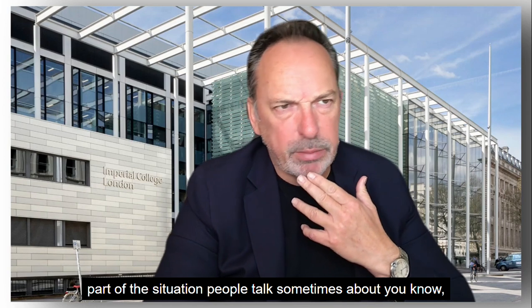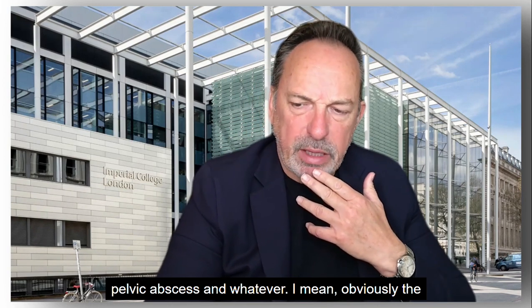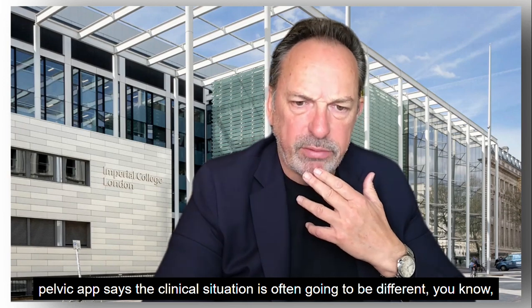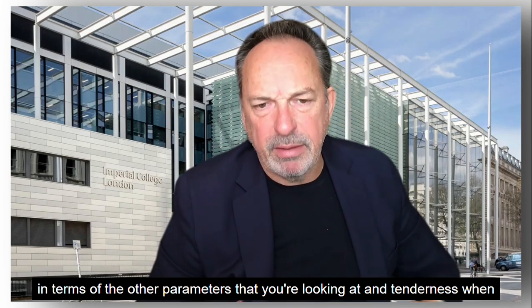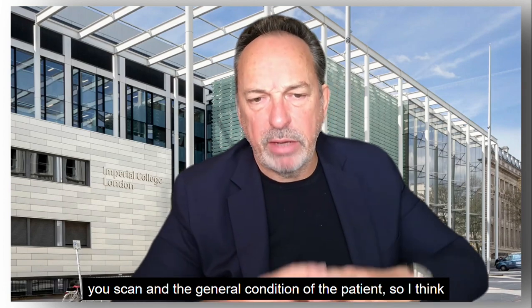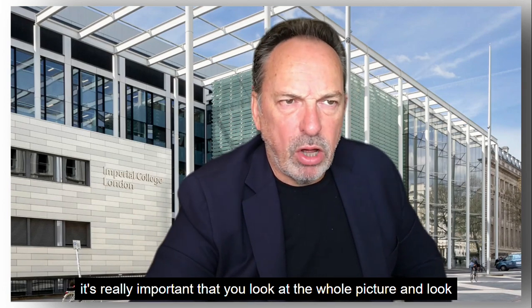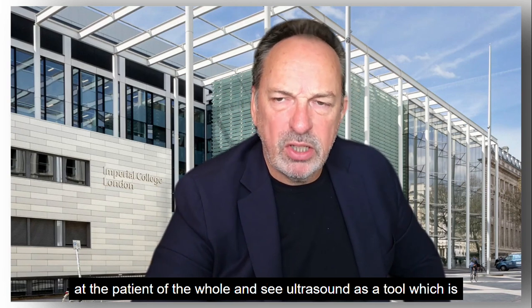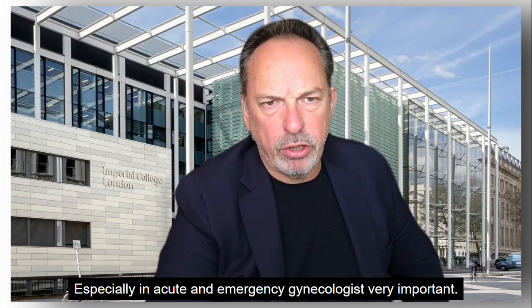People talk sometimes about pelvic abscess. Obviously, in a pelvic abscess, the clinical situation is often going to be different, in terms of the other parameters that you're looking at, and tenderness when you scan, and the general condition of the patient. So I think it's really important that you look at the whole picture and look at the patient as a whole, and see ultrasound as a tool, which is part of the assessment, especially in acute and emergency gynecology. It's very important.